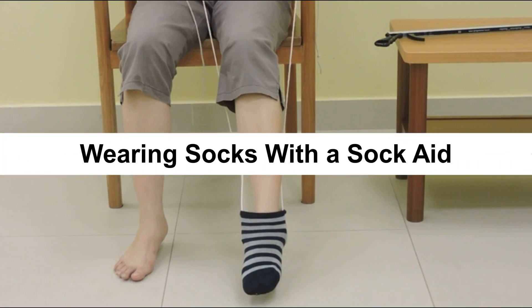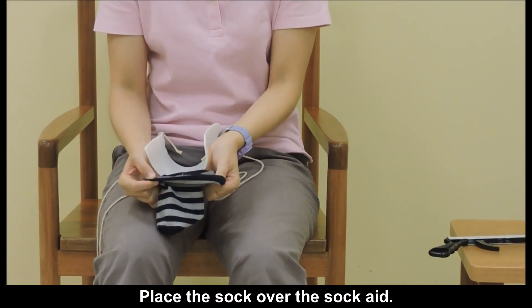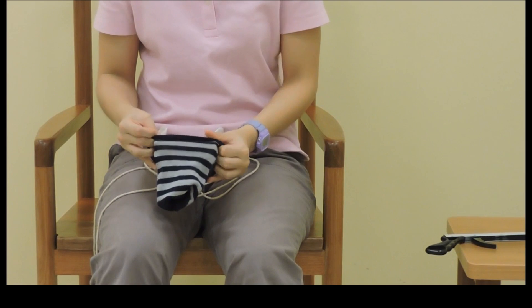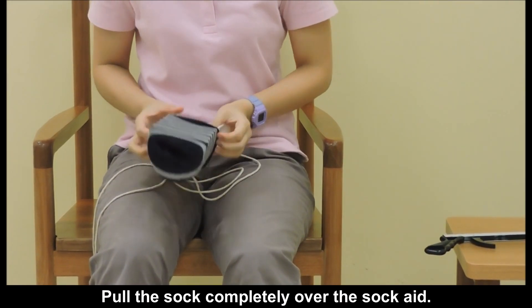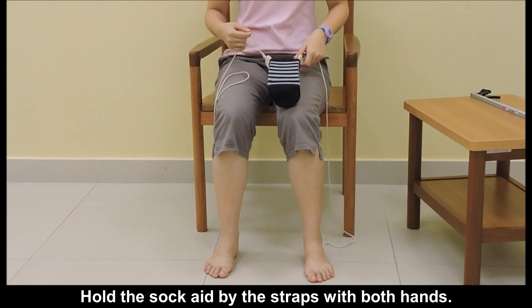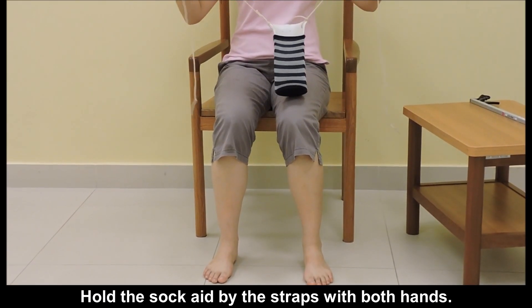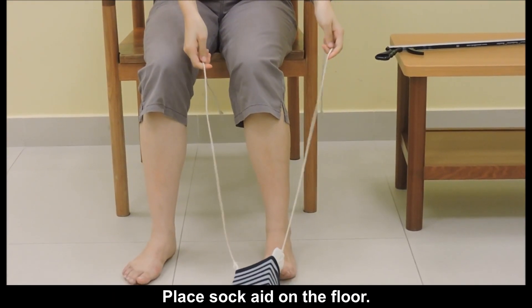Wearing socks with a sock aid. Place the sock over the sock aid and pull it completely over the sock aid. Pull the sock aid by the straps with both hands, then place the sock aid on the floor.